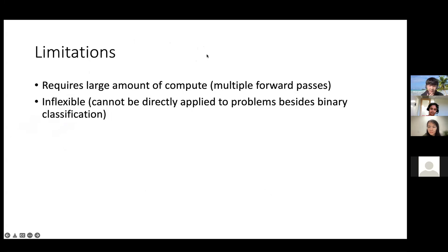And then lastly, another important consideration is data efficiency. So using MIL, in each iteration of the model update, we're only learning from a single patch, namely the patch with the highest predicted tumor probability. And as a result, the algorithm might need a very large amount of data to learn effectively because your gradient signals can be very noisy coming from a single patch. And effectively people show that you typically need on the order of thousands, if not tens of thousands of slides just to do well on some relatively simple tasks.